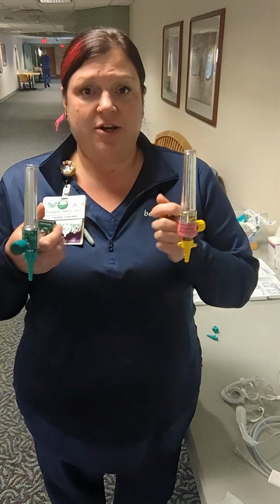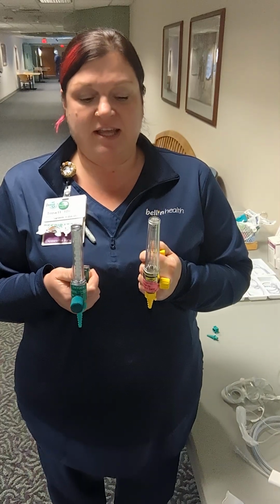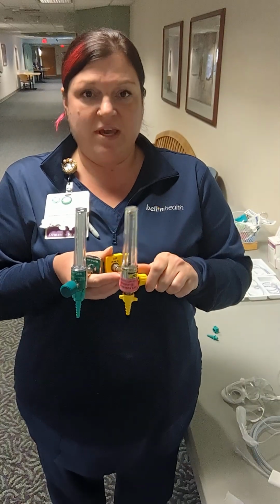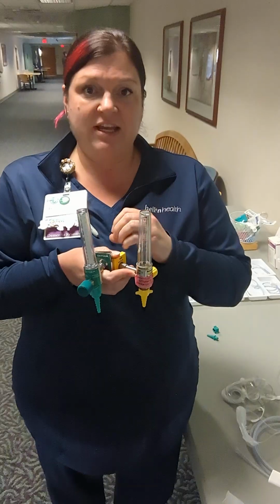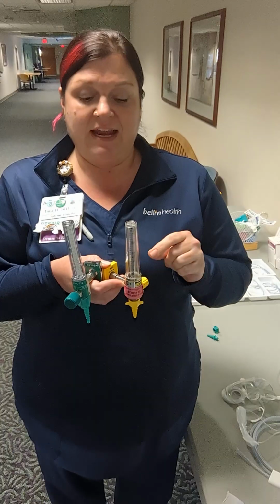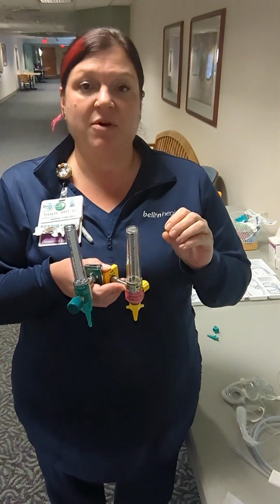So starting, we have flow meters, right? These are devices that measure how much gas we're using and how fast it's coming out. When we turn these little dials on the sides, what that does is it's opening up a valve and allowing more gas to come through. And as we're measuring it, we do that in units of liters.